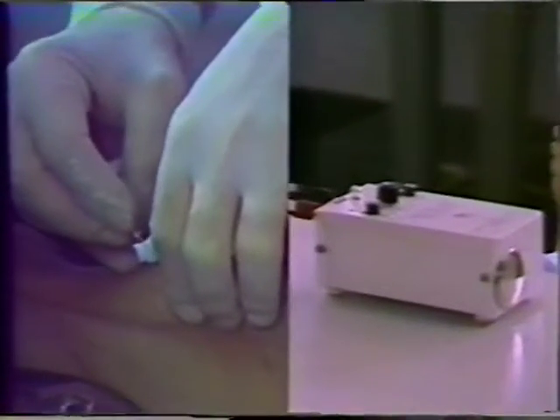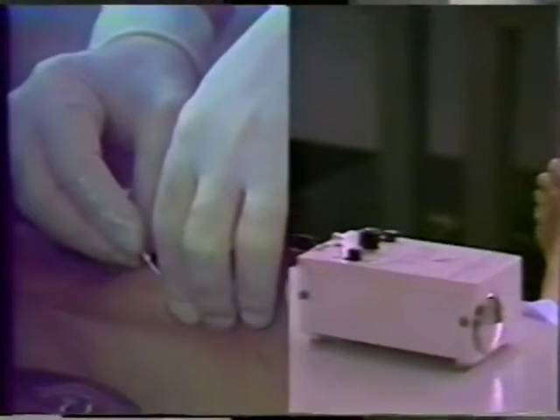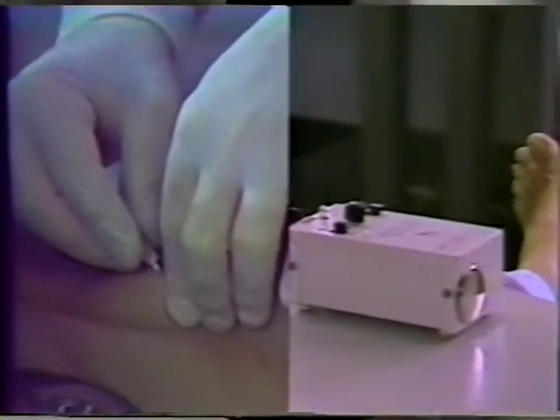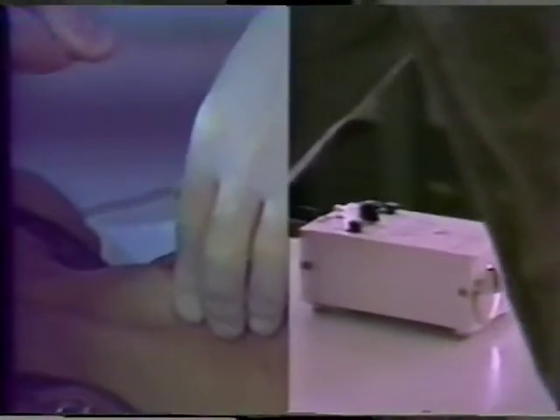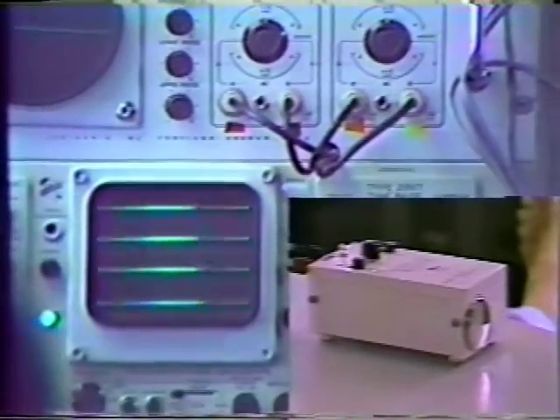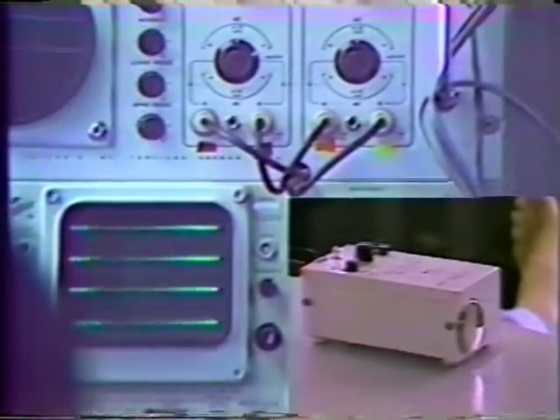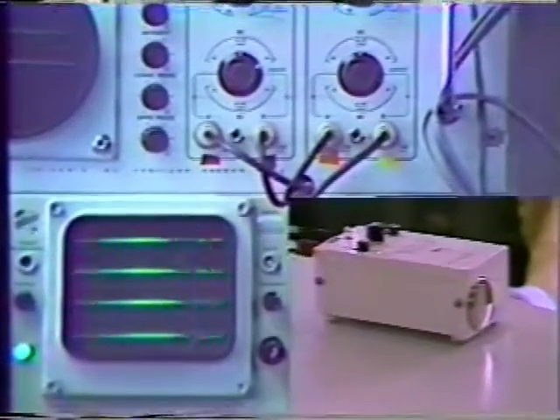Electrode placement to the cricothyroid muscle is accomplished by palpating the exterior neck and inserting the needle along the lower border of the cricoid cartilage. We have several tests that must be passed before we consider the placement as being accurate in the cricothyroid muscle. The first is that muscle activity should increase as the subject increases his vocal pitch. The second test is that vocal pitch should elevate when the muscle stimulator is turned on.